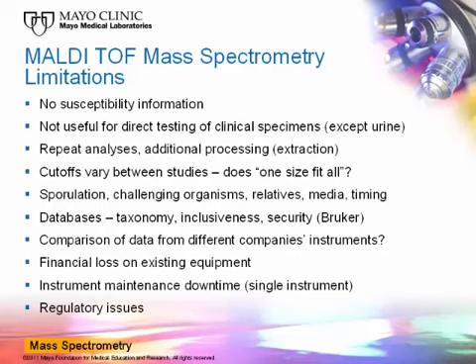Comparison of data from different companies' instruments is not feasible. Laboratories acquiring the needed equipment will suffer financial loss on existing equipment. Finally, the available systems are not approved by the United States Food and Drug Administration.